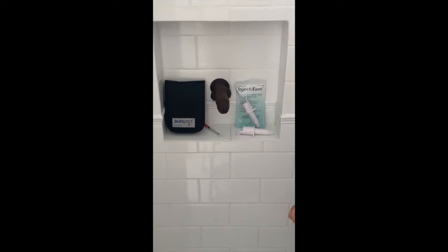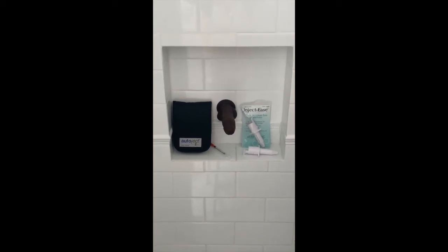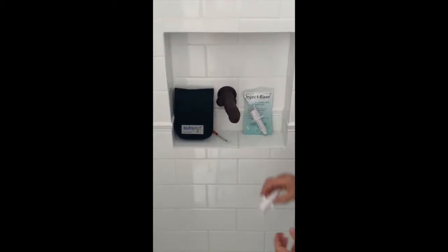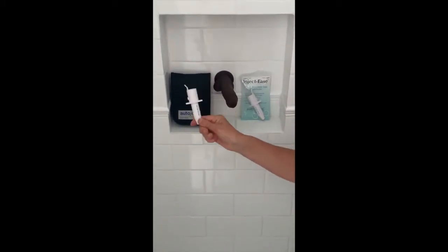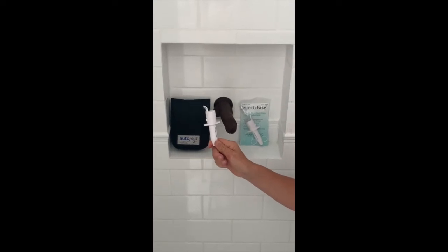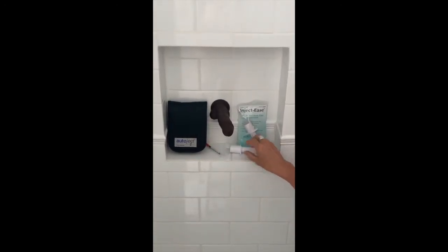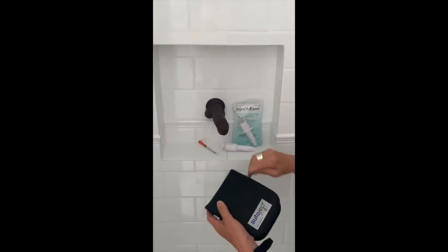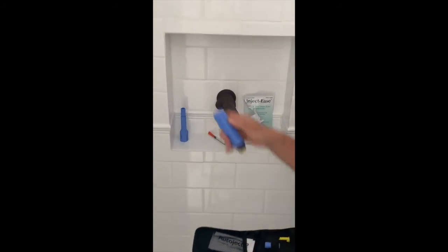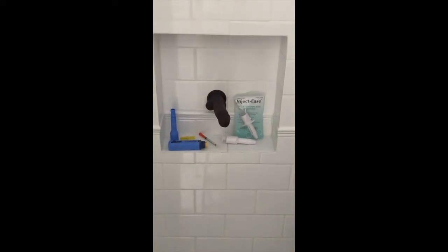What we're going to do now is talk you through using two different types of auto-injectors. What we have here is James — we're using James instead of Jeffrey today. We have two auto-injectors: one's called the inject-ease, which is probably what we've been using the most of, but there are two steps with the inject-ease, which can be a bit more difficult for people with shaking hands. The other option is called an auto-inject-2. It has more parts and is a little more complicated to put together, but it is actually surprisingly easy to use. We'll go through them both.